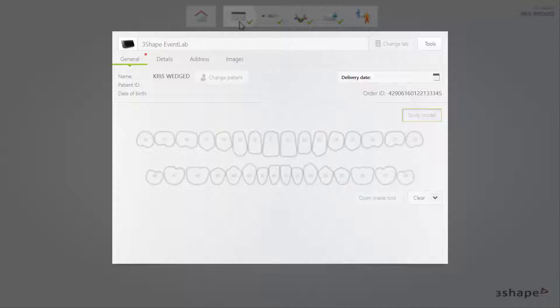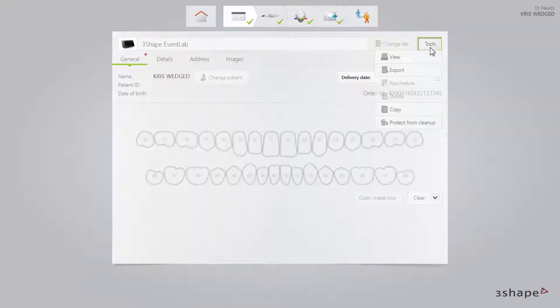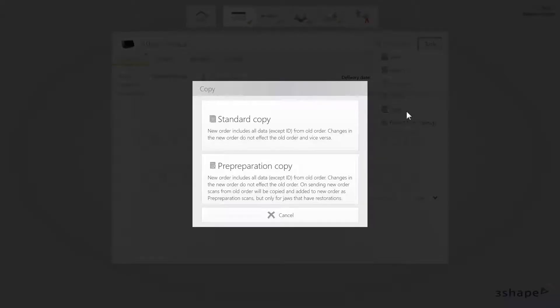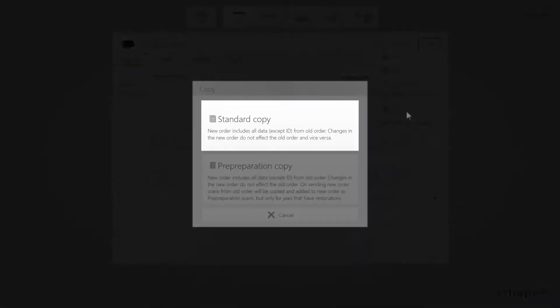Once in the order form window, to create a pre-preparation copy, click on the Tools button and then click Copy. There are two options in the copy window. The standard copy includes all data from the old order, apart from the order ID, which will be different. All modifications done to the new order will not have any influence on the old one.